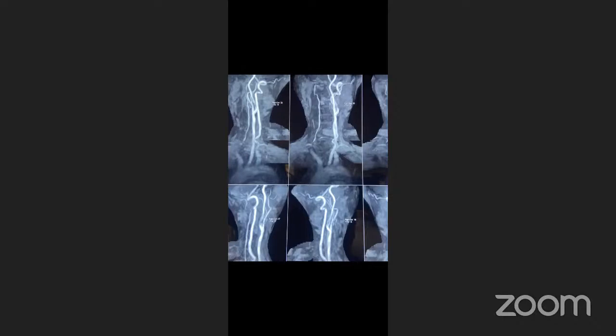So I don't have the angio actually. When I did the angiography, my first shoot was from the left subclavian, and it surprised me. It was a good steal, even though the right vertebral is hypoplastic. I can see the blood is coming retrograde from the right vertebral and reforming the subclavian and going to the arm. Second, even the left vertebral is so big, the whole right side circulation is supplied by the left vertebral.